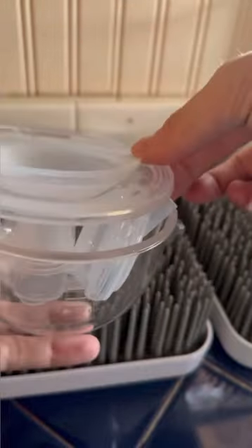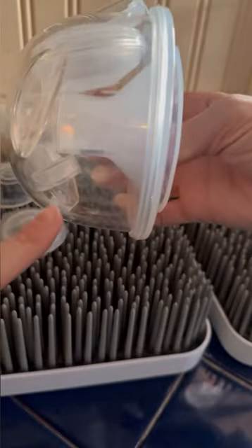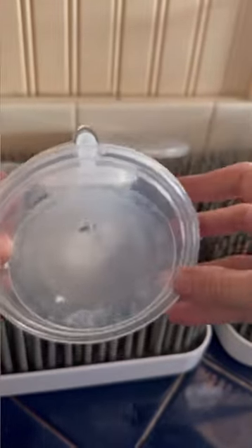Now let's put it back in. And then we're going to seal this silicone part just like that. Now, whenever you put it on your boob, that part's going to be down — that's where the milk is going to come out. This part is where the tubes will go inside.